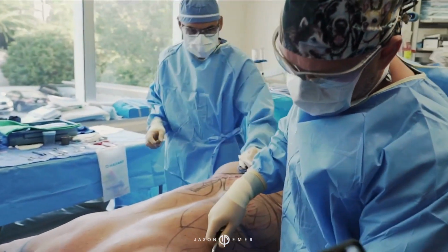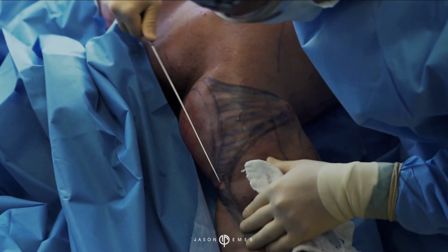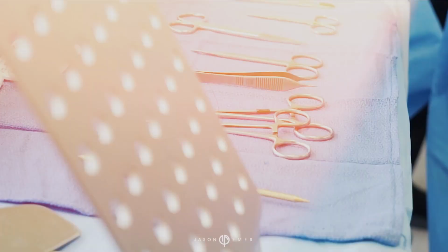So we're putting fluid now into the arm so we can lift the arm and show the bicep. This fluid is the tumescent that's going to numb him, but he's asleep, so the goal is to get the numbing solution in here that has medication to stop the bruising and swelling.